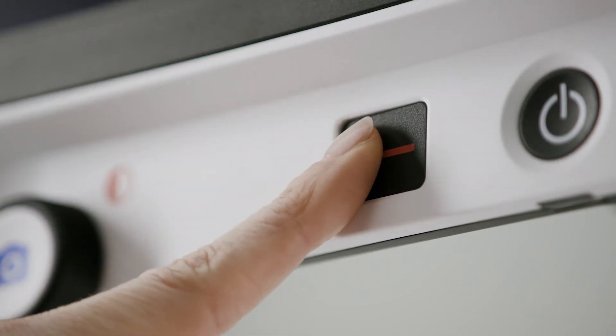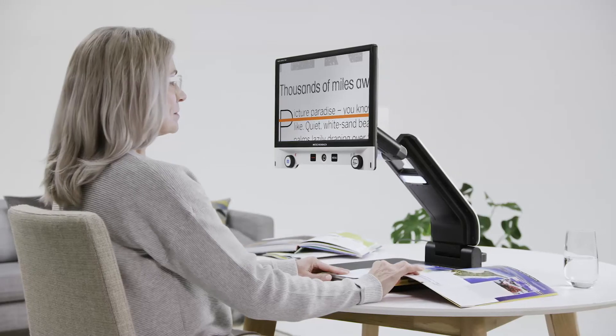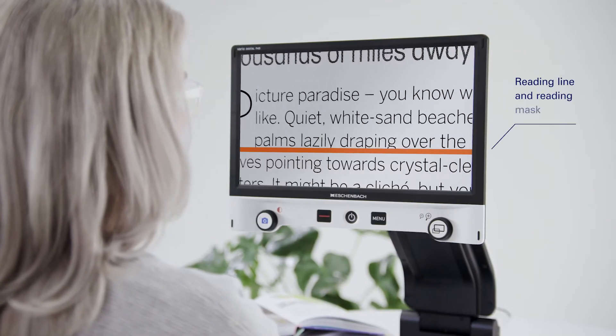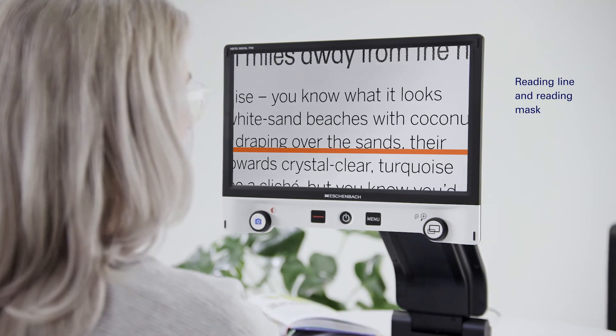Orientation guides can be switched on to achieve a better overview. These can be used horizontally for line alignment or vertically for column alignment.